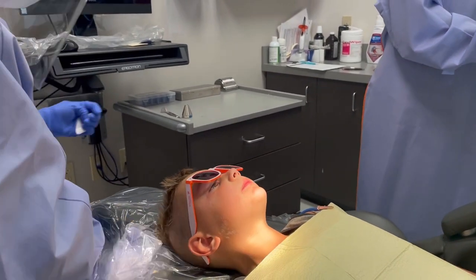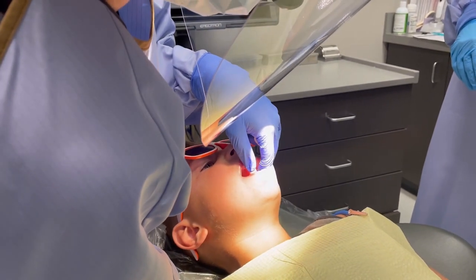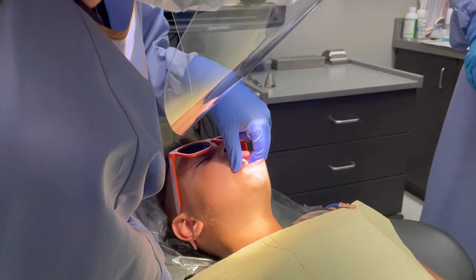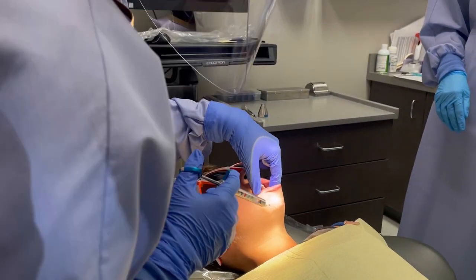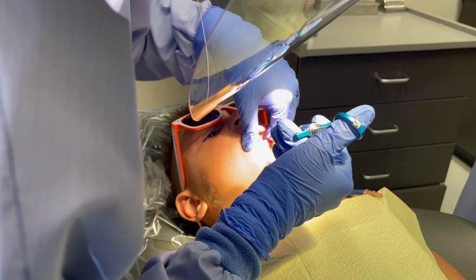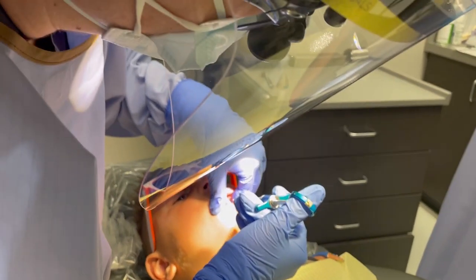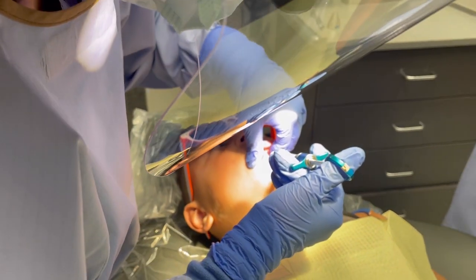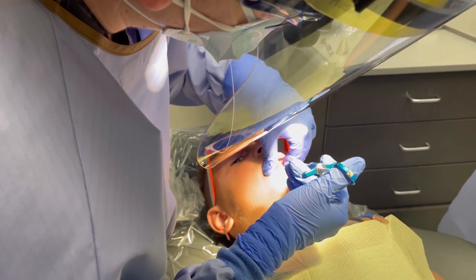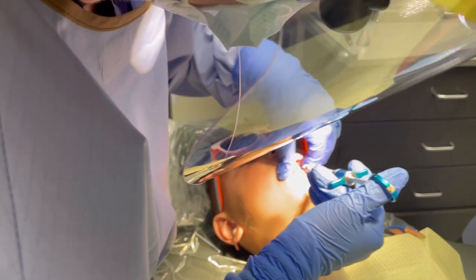Now just close your eyes and just relax — she's almost done. So this next part, I'm just going to give it a nice little drink of some sleepy juice. So just take some nice deep breaths for me, okay? Nice deep breaths. You're just going to feel me jiggling your cheek here, and we're just going to give it a little Slurpee straw here. I'm going to go nice and slow — teeth are very thirsty, so it takes a little bit of time to give it a nice, long drink of sleepy juice. I like ice cream after dental work — that's my favorite.